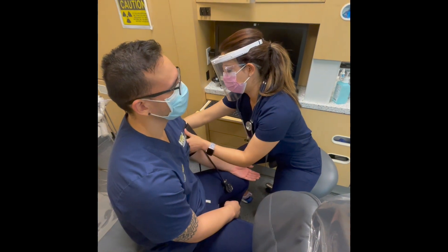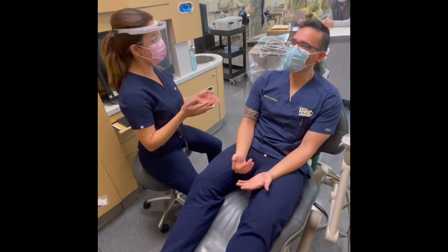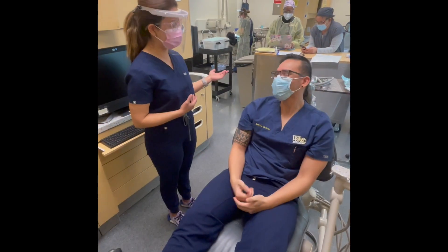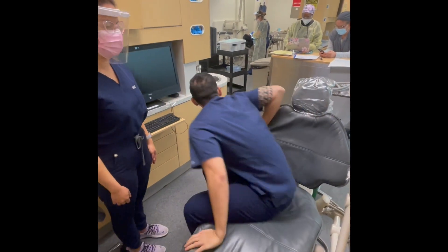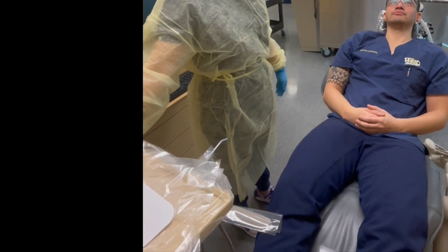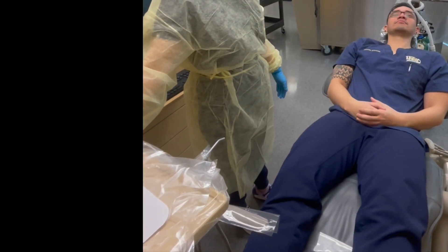Take and record your patient's baseline vitals. Communicate the sedation process to your patient, allow them to ask questions, and make them feel at ease. Then ask your patient to please visit the restroom so as to avoid the termination and initiation process of nitrous sedation. Position the chair in a supine and comfortable position.